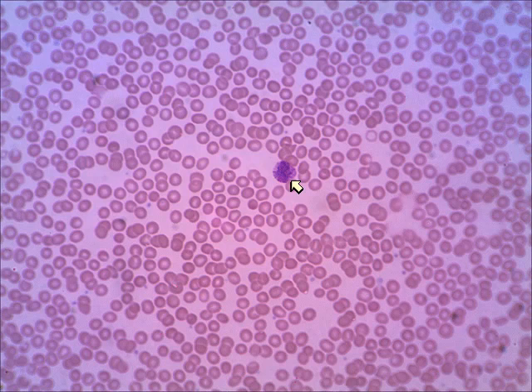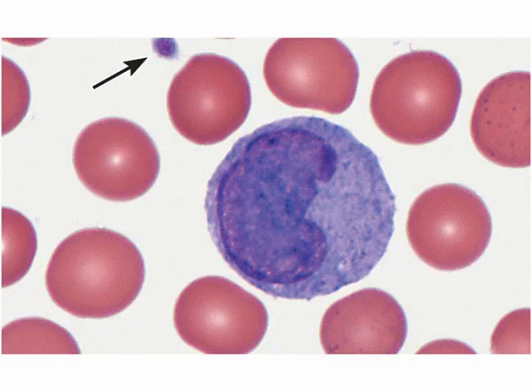And as I was talking about it being a monocyte, I thought, well, it has a real grainy cytoplasm, but that's because it is a basophil. See the little dark specks in the cytoplasm? All right, let me erase these arrows so you can see that better. So that is a basophil. Of course, that was easier to identify on the higher view. Let's look at this next slide.